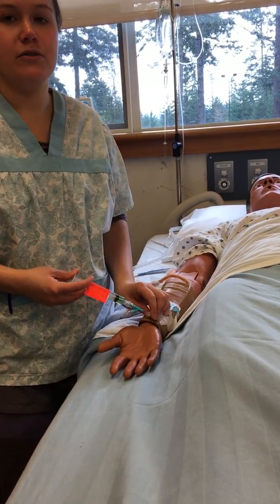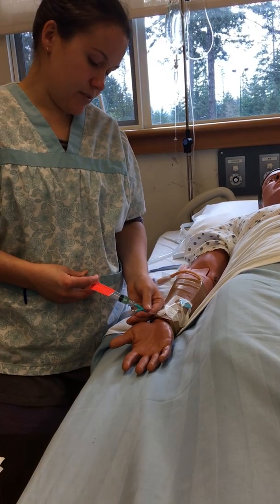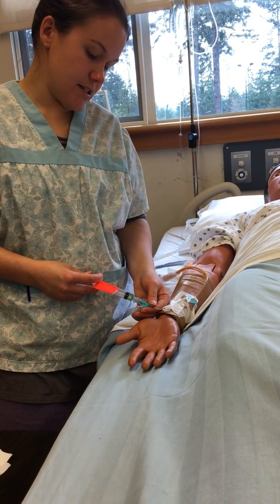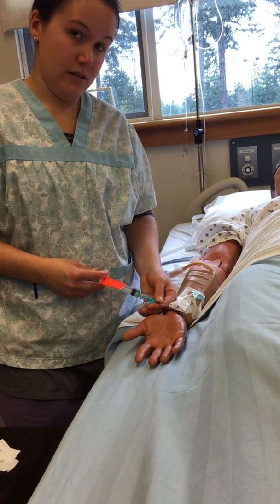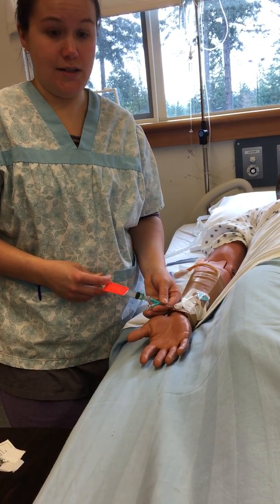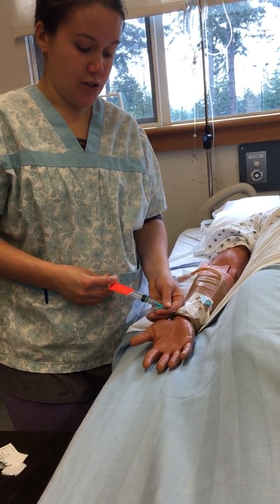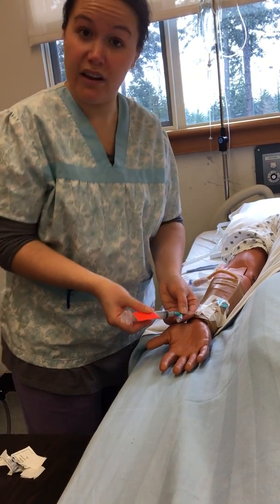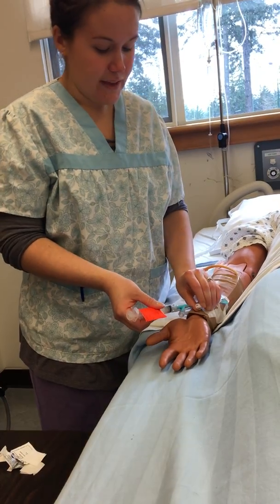Oh, unclamp, of course. Push this ever so slowly over 1 full minute. So I'll be watching the clock. I want to get to the 1 mil at the 30 second point. So I'm just gonna push this a little faster, but we'll say that I did it over 1 minute. I just won't put you through that. Okay, now I clamp.